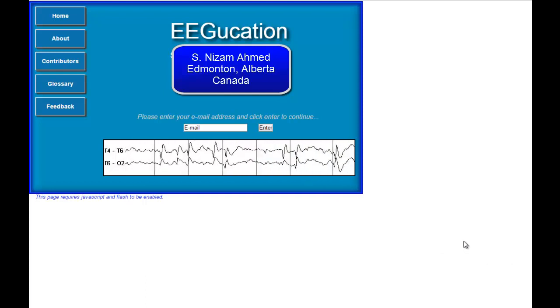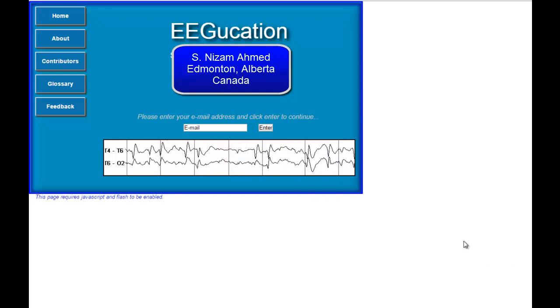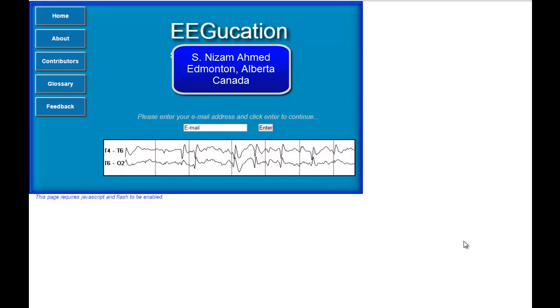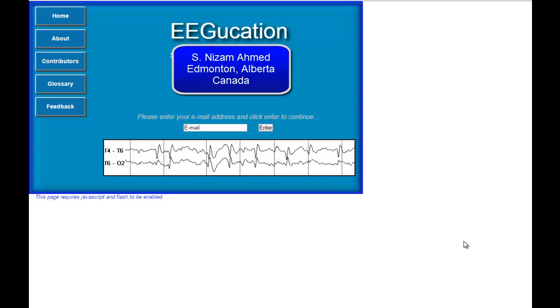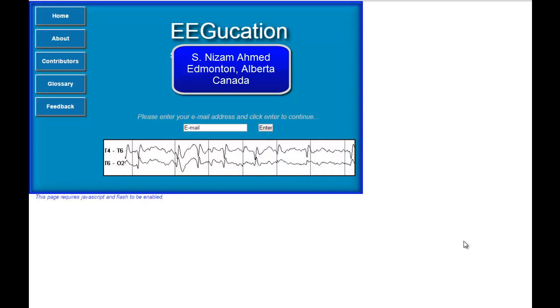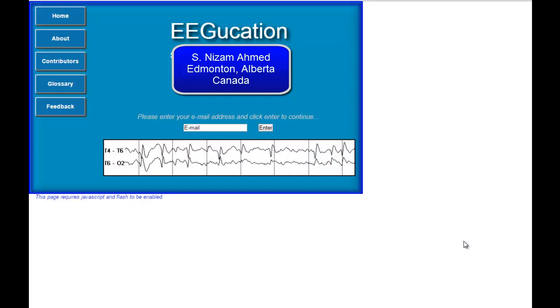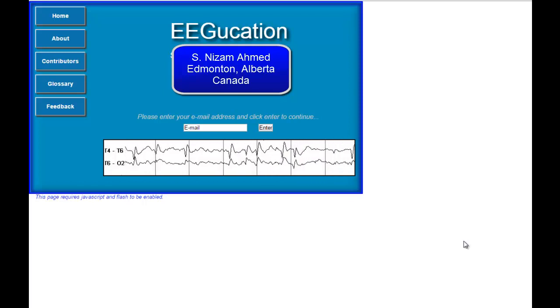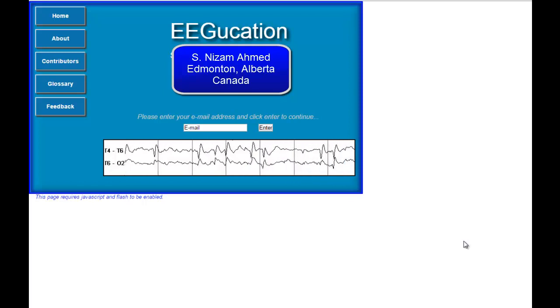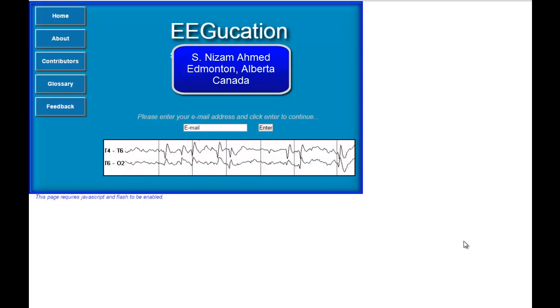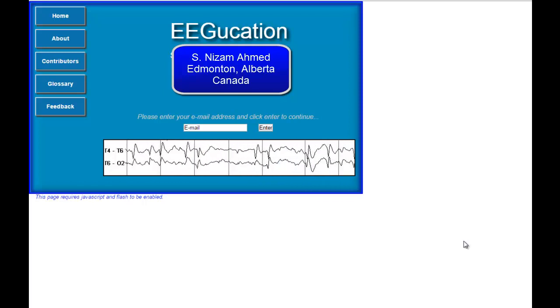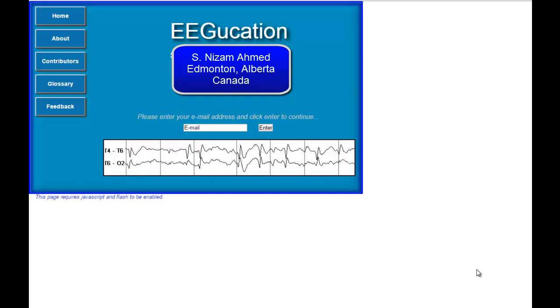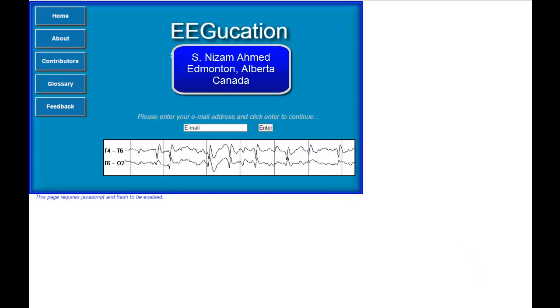Hello. I have had a number of requests to go over some of the common imaging findings in patients with epilepsy. We'll go to Chapter 8 today and review some of the common MRI and CT findings in patients presenting with epilepsy.